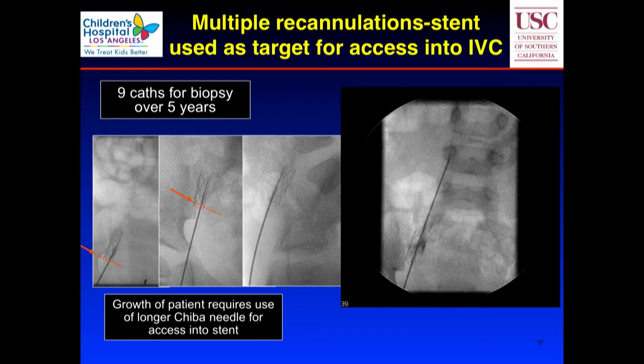We always worry, but we're okay. We start off with very thin wires, and if you perforate with a thin wire, the bleeding is going to stop. So I don't worry about big bleeding. Just like if they poke you and hit your blood vessel, but they pull out the IV, it's going to be a small amount of bleeding. That could happen. But that's why we start off with very small wires first.